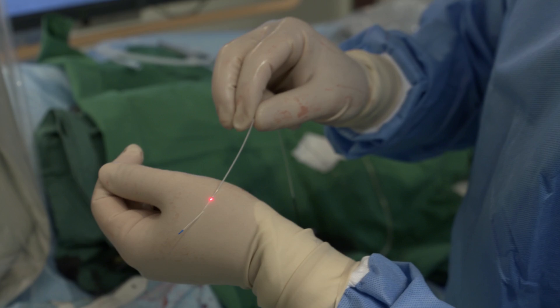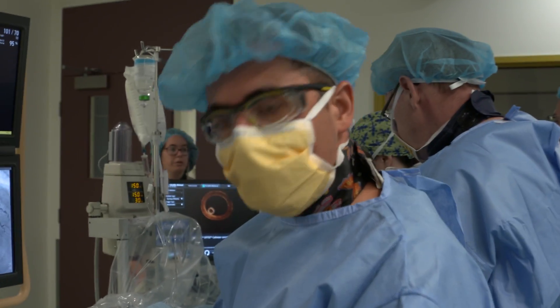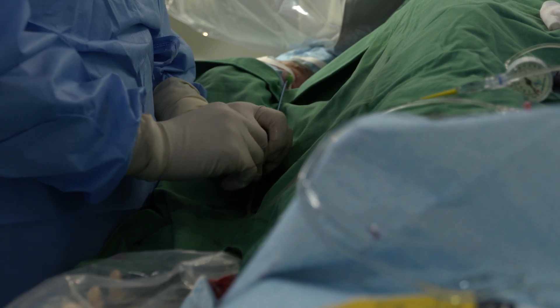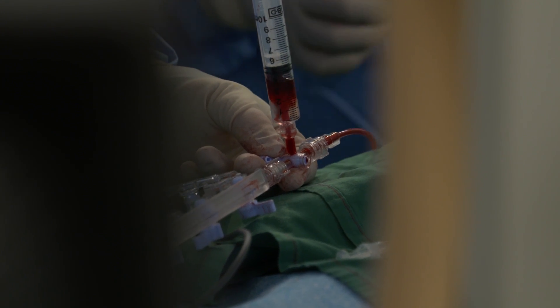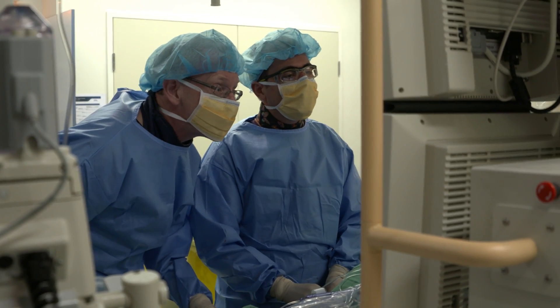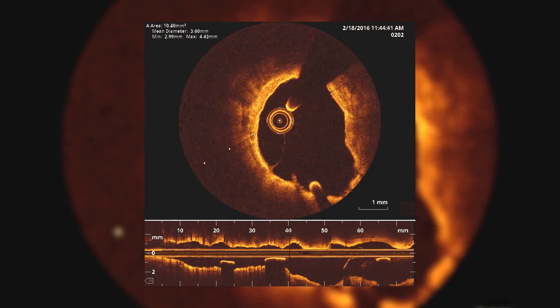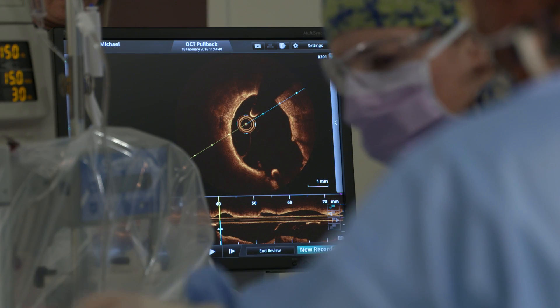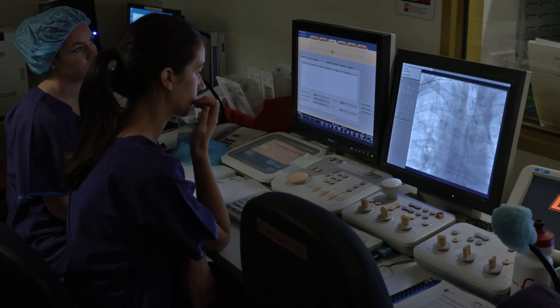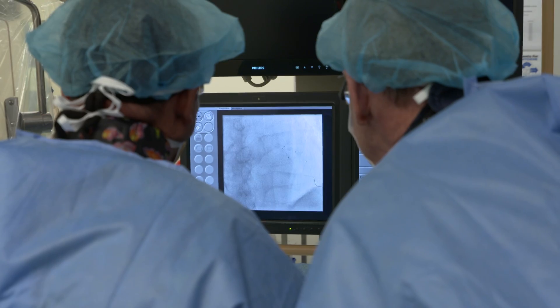That's the camera we use to look inside the artery. Today we did a case involving OCT — optical coherence tomography — a very powerful technique that gives very high resolution pictures of the inside of coronary arteries and coronary stents.